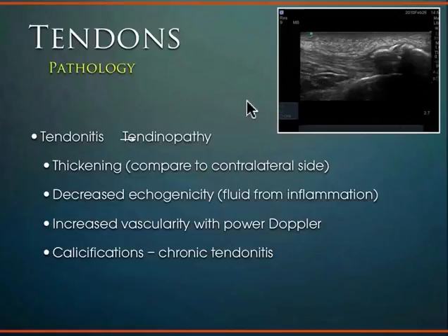As opposed to tendinopathy or chronic tendon problems, it's going to be more thick tissue, disruption in the actual tendon tissue and architecture. There's going to be thickness. There's going to be changes in the echogenicity in the tendon itself. And as I mentioned earlier, in terms of power Doppler, with tendinopathy or chronic tendon problems, there tends to be new vessel formation, we call neovascularization, in the tendon.